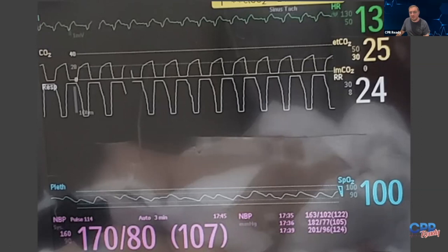So this is a patient that is hyperventilating, right? Because they are breathing at 24 per minute, so they're tachypneic. Again, just a little bit over 20 is still significant. And I have a 911 Cast podcast episode all about respiratory rate. It's one of the most sensitive vital signs that we tend to make up, right? Everybody's got a respiratory rate of 18. Shark fin, high respiratory rate, low end tidal CO2 because of it. This is a patient that truly is having significant bronchospasm and needs intervention. They need treatment for it. And as this patient gets treated, this will all start to normalize. And this shark fin is going to start to look more and more normal.